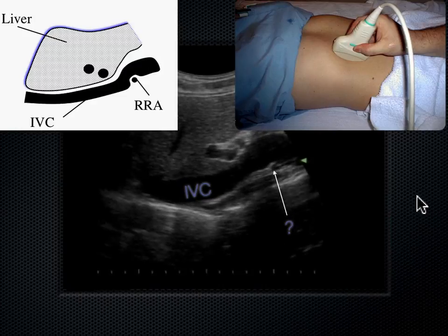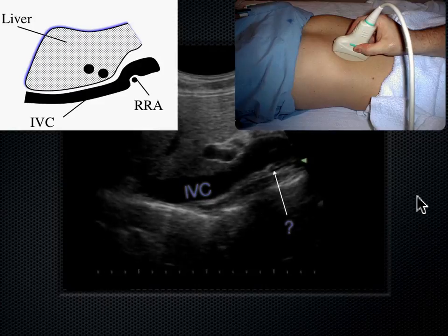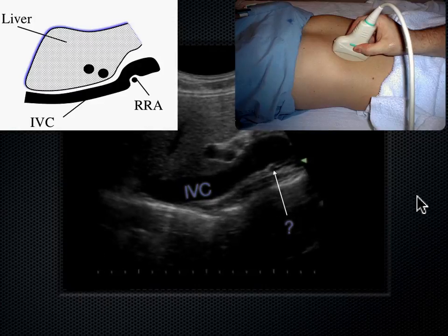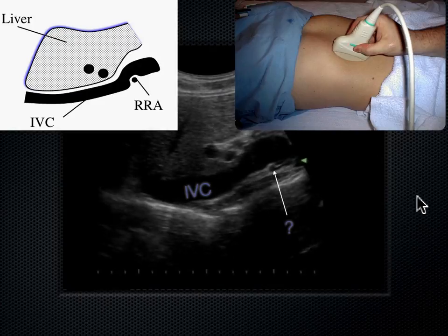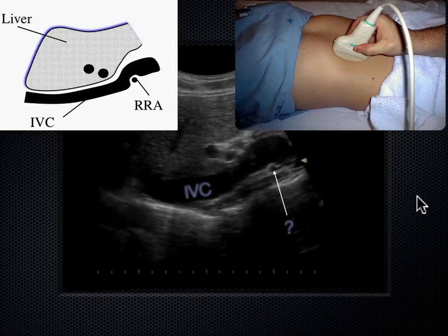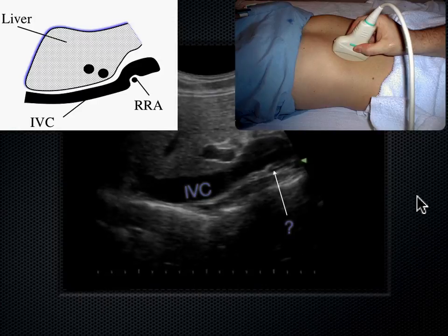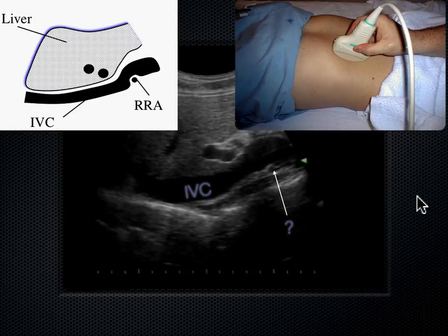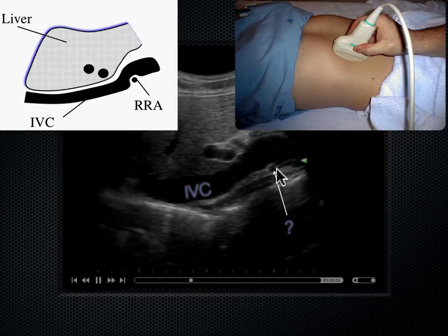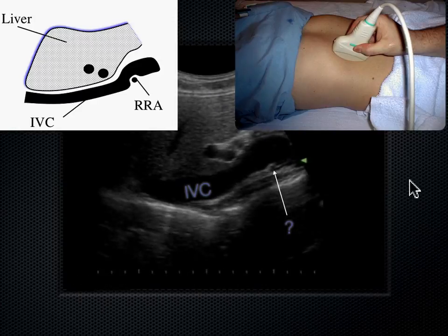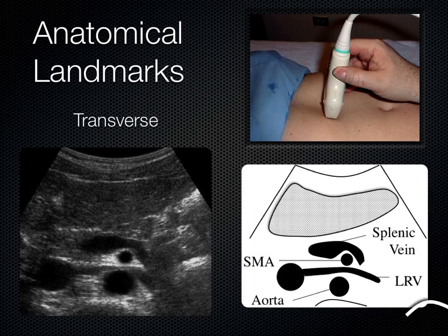That vessel is the right renal artery. Blood travels from the aorta on the left side of the body all the way over to the right kidney on the right side of the body by going behind the IVC. That's a landmark we see frequently on ultrasound.